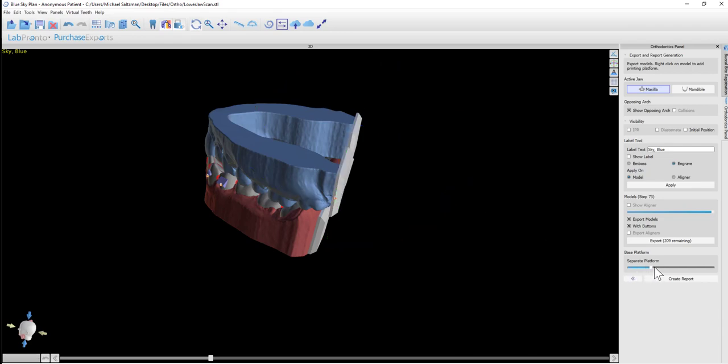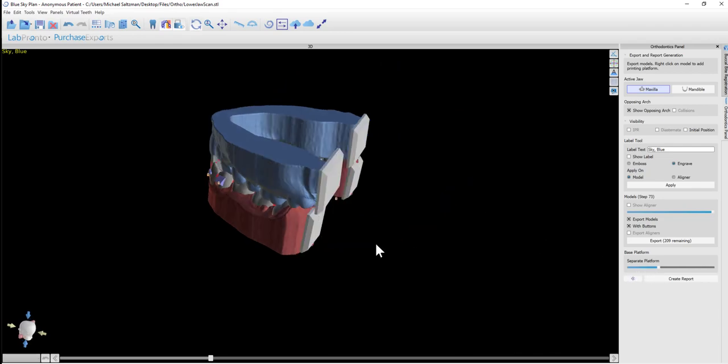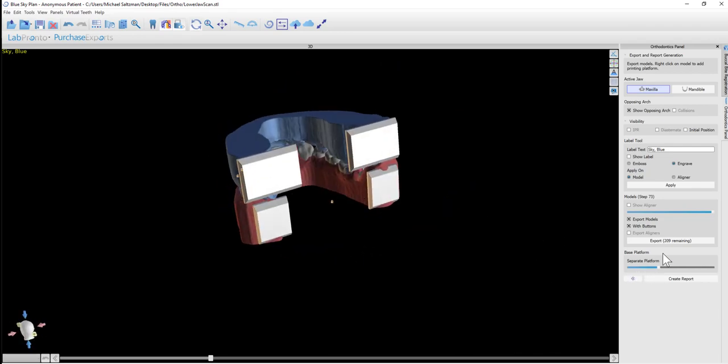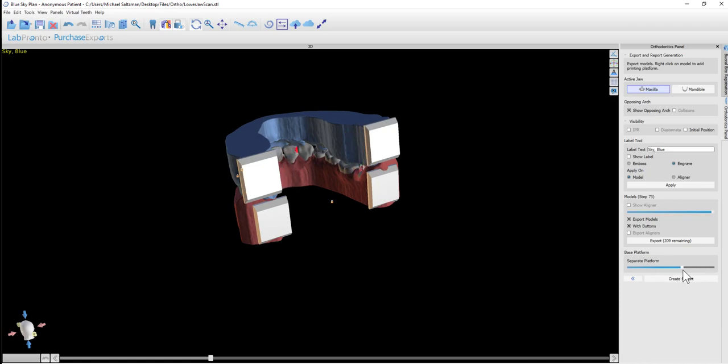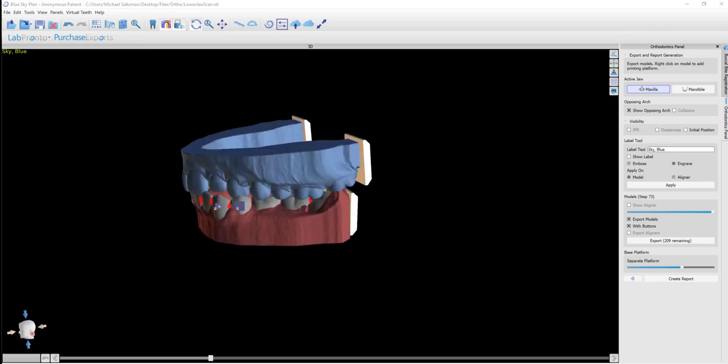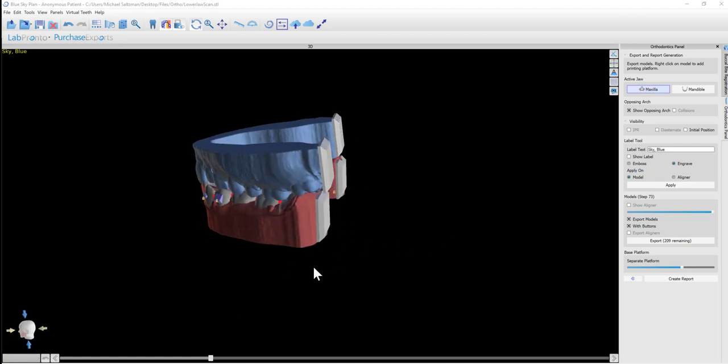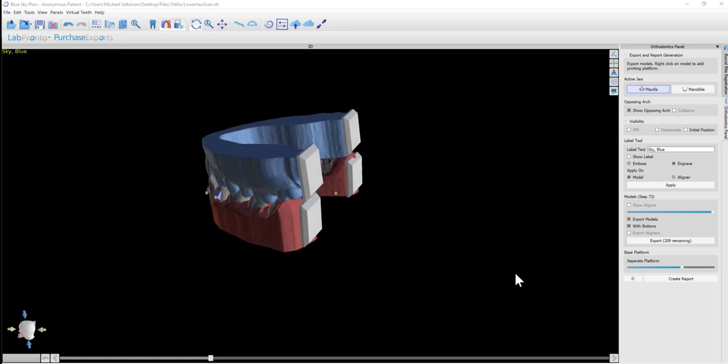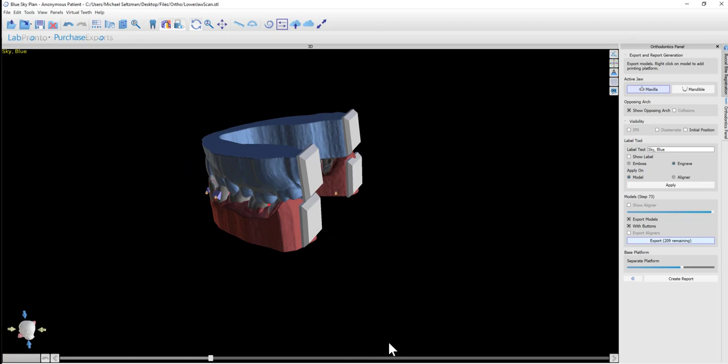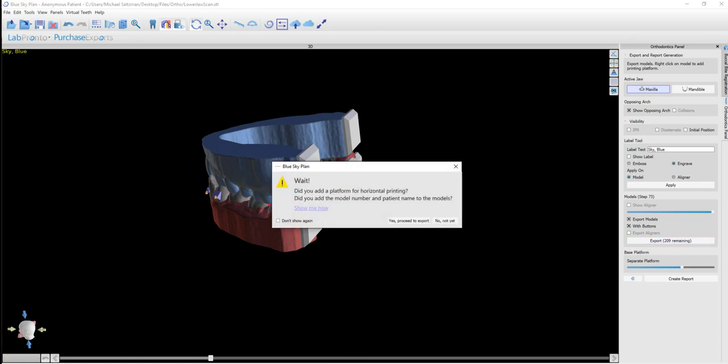We could go ahead and add a platform to the maxilla the same way and again fine-tune the positioning. If we like, we could go ahead and separate the platform. Once we've embossed or engraved the label and the model number on both models and once we've added the platforms to both models, we could go ahead and click on Export.